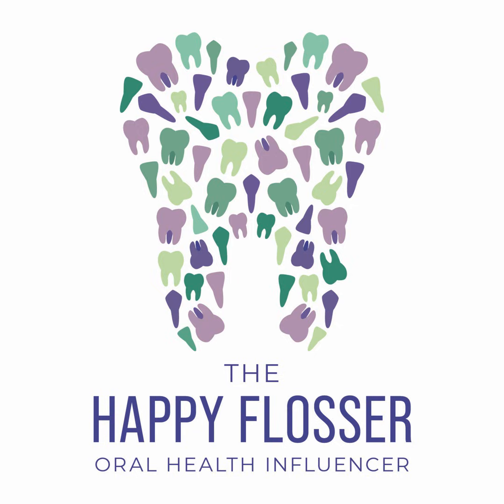When you are doing the maxillary molar positioning for the image, you are using the yellow posterior rim and you're going to place the sensor parallel to the lingual surface. The central ray is centered on that second molar. If there's a third molar, you might want to try to move the central ray to the embrasure space between that second and third molar. Tilt the sensor slightly to capture those apices of the third molar.